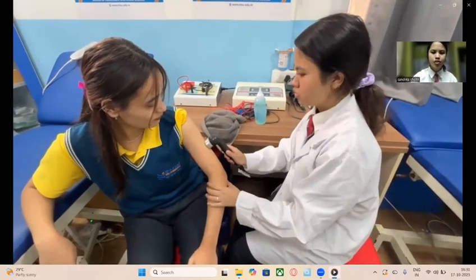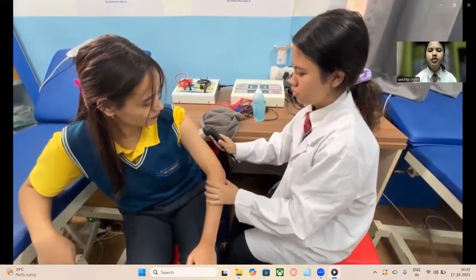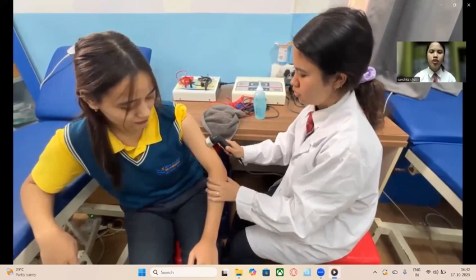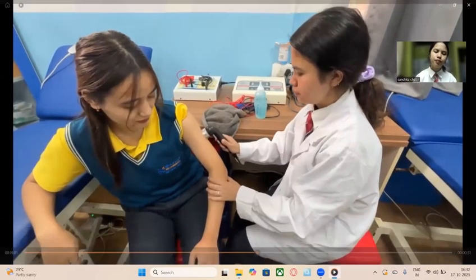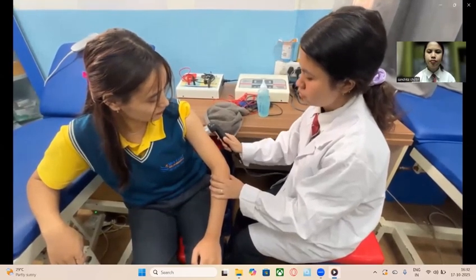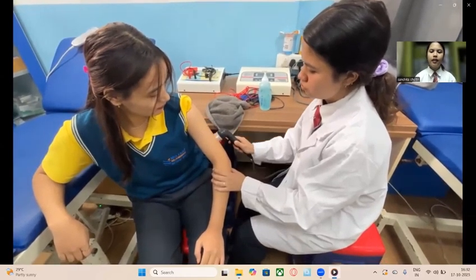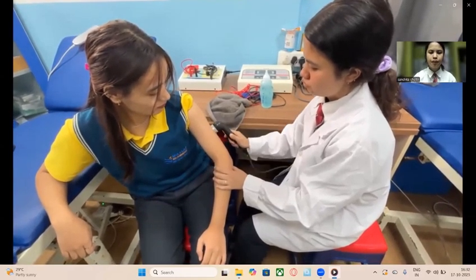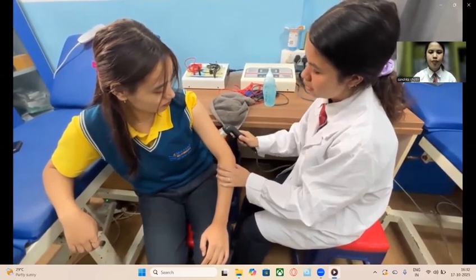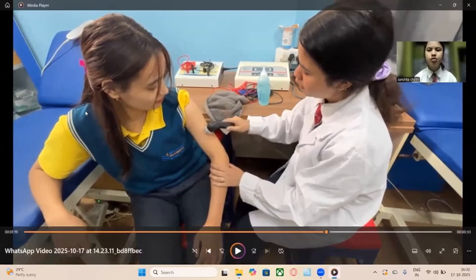This is the transducer. I am placing the transducer head gently on the gel and moving it in circular motions over the affected area.